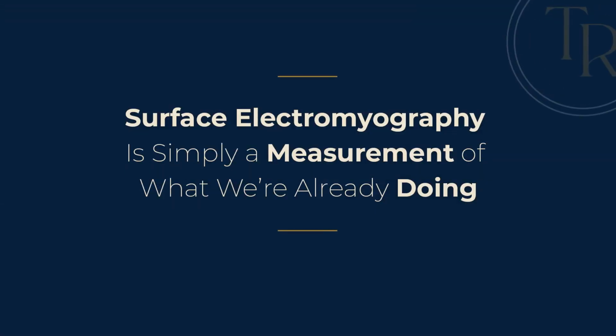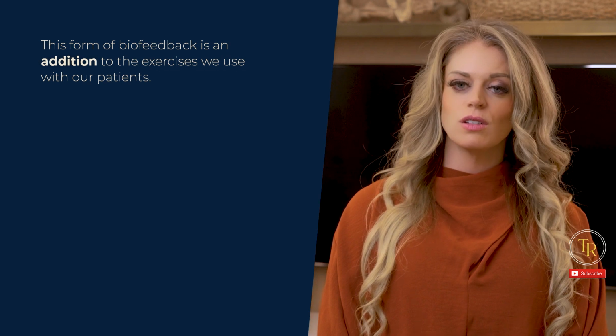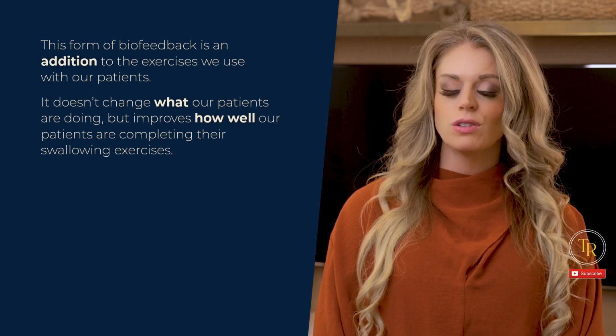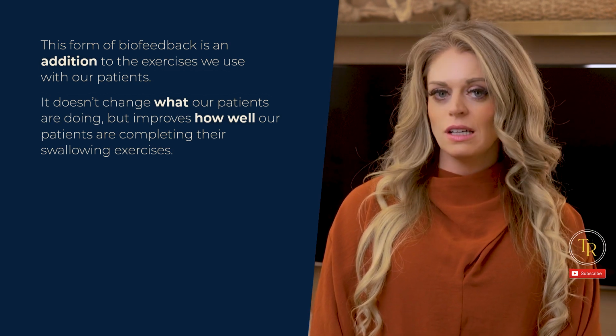Surface electromyography is simply a measurement of what we're already doing. This form of biofeedback is in addition to the exercises we use with our patients. It doesn't change what our patients are doing, but improves how well our patients are completing their swallowing exercises. So let's discuss what it does and what it doesn't do.